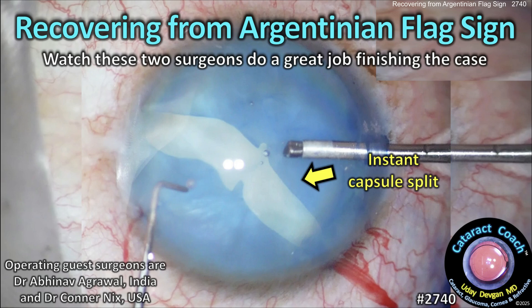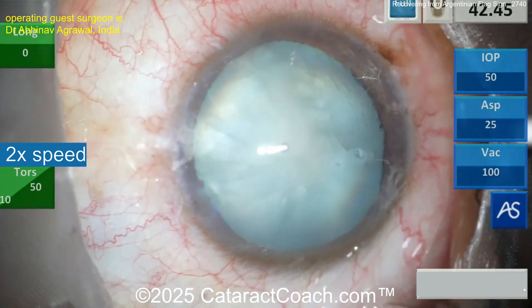CataractCoach.com. Recovering from Argentinian flag sign. Watch these two surgeons do a great job finishing the case. Now this has happened to all of us. Our first case here we have Dr. Abhinav Agrawal from India.